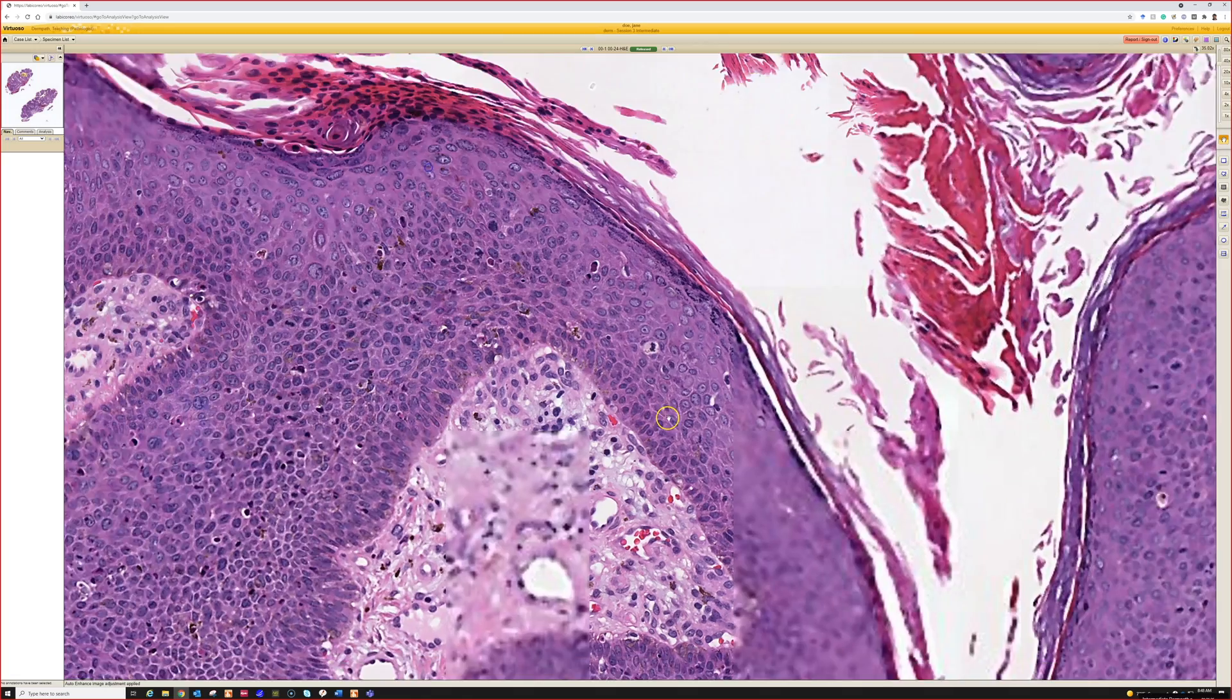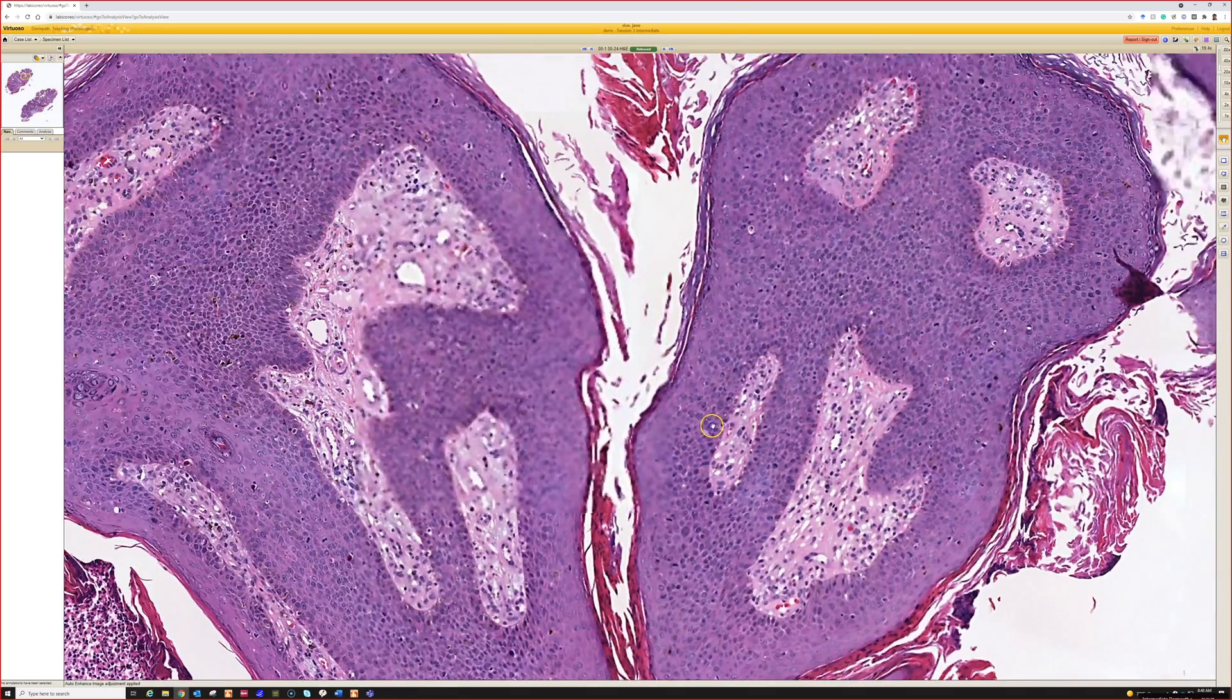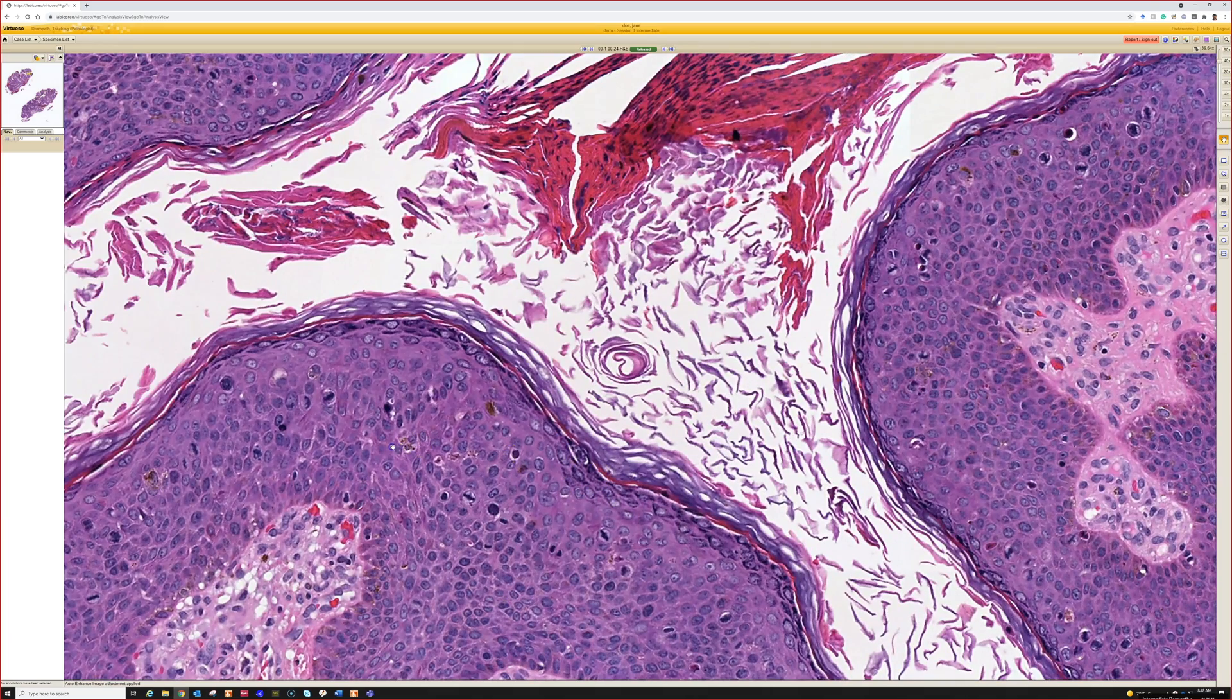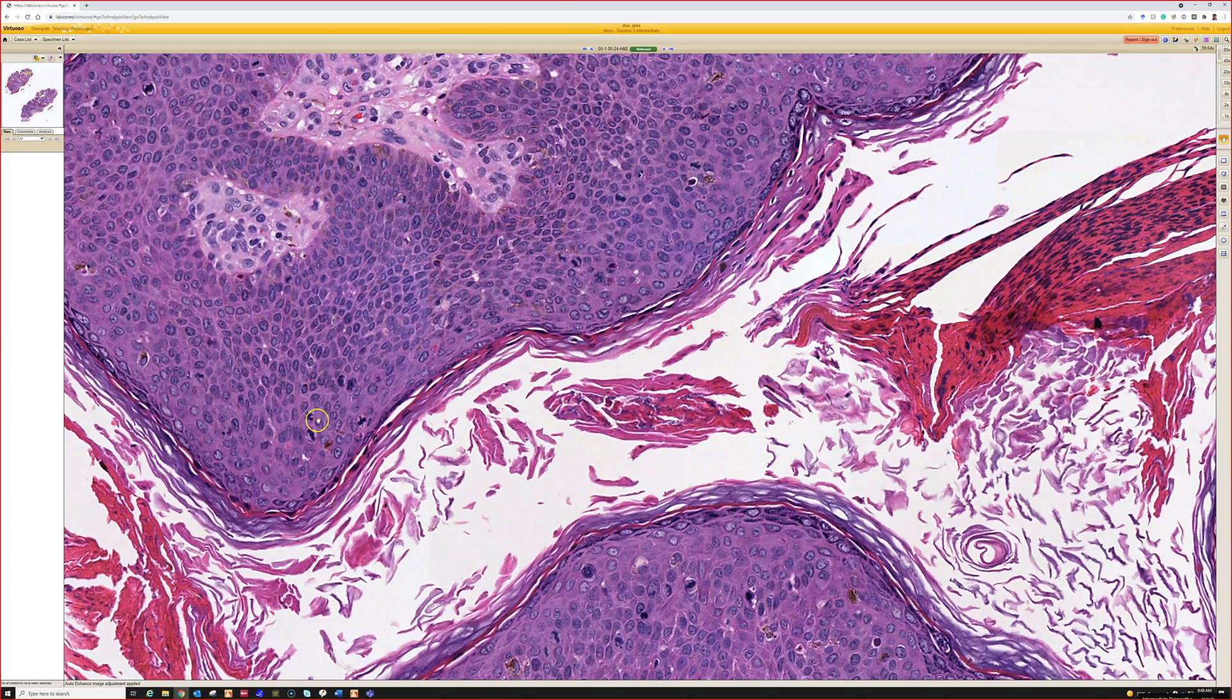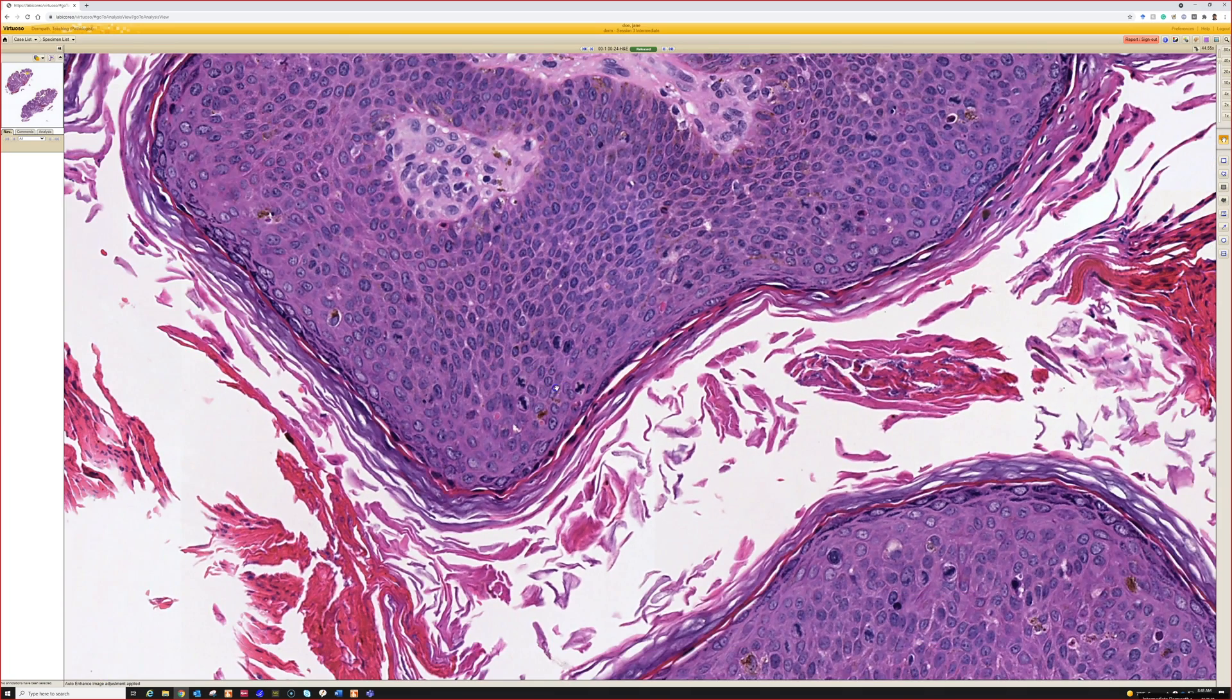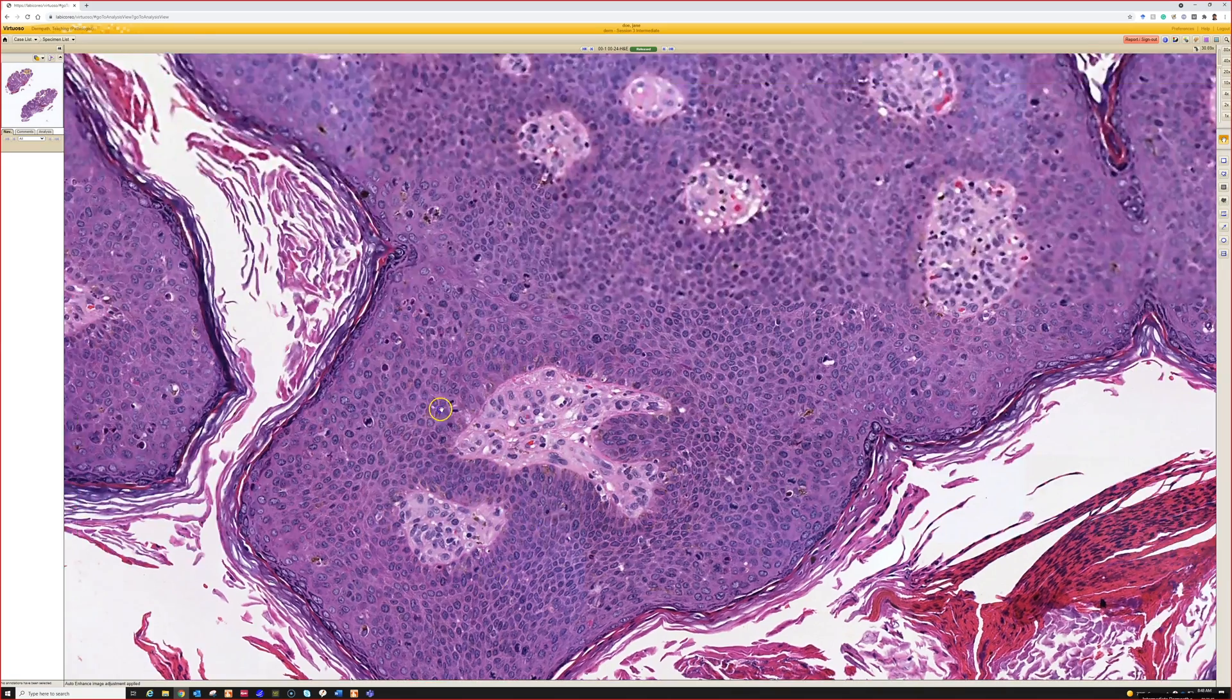And this is in the genitals, so this looks like a condyloma almost, but it's got full thickness atypia. It's got some areas that look like they might be coilocytes, and if you did a high-risk HPV—look, there's like X marks the spot—there's two or three X mitoses right here way up near the granular layer.